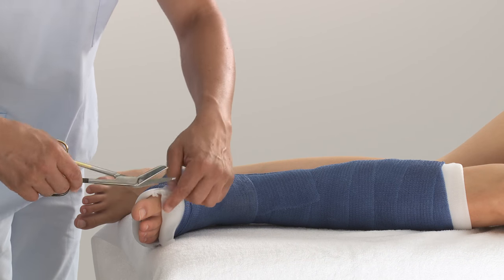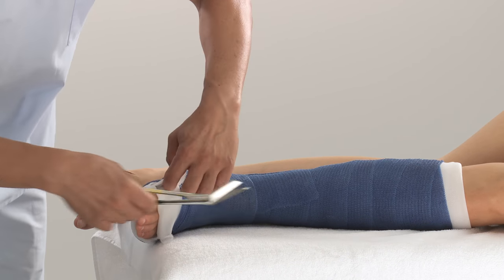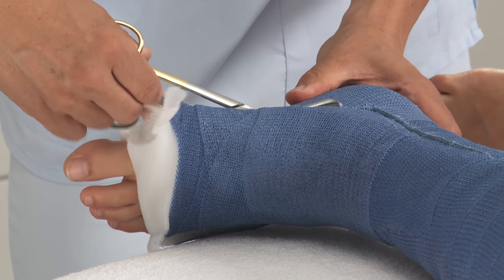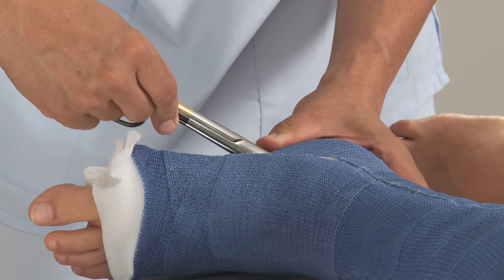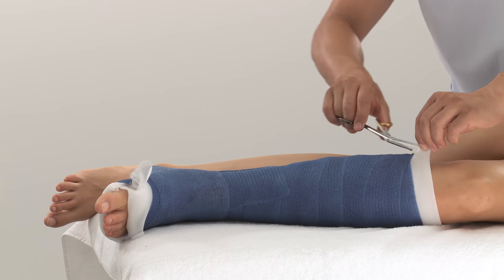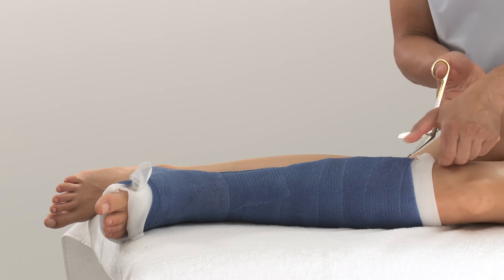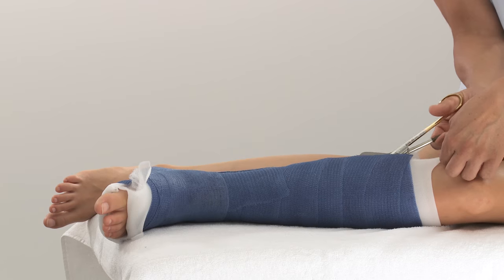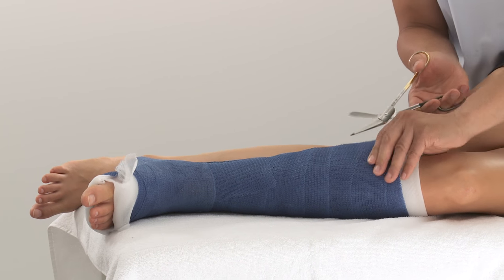Now cut along the inside saw line, starting at the foot towards the ankle. Then cut from the top of the leg moving downwards. Ensure you cut through the padding and top layer of the stockinette.